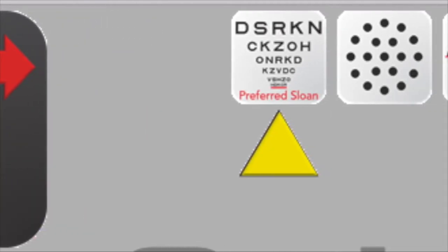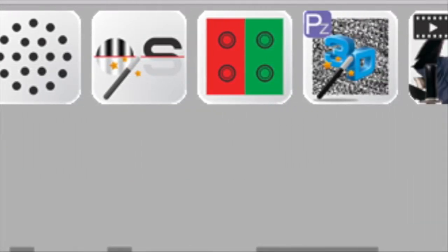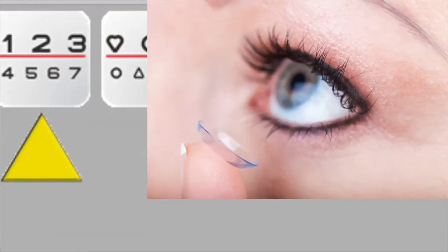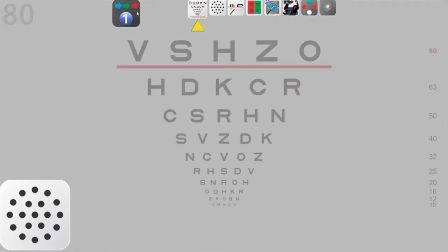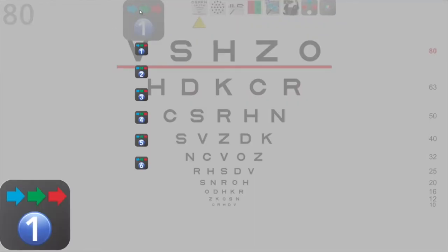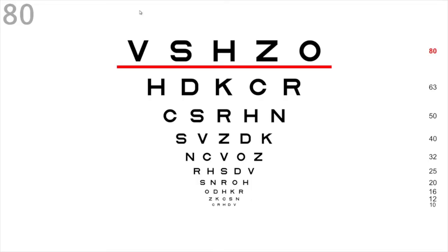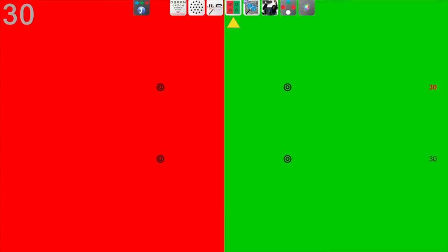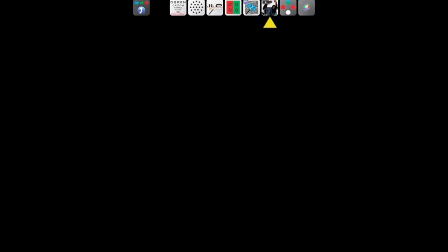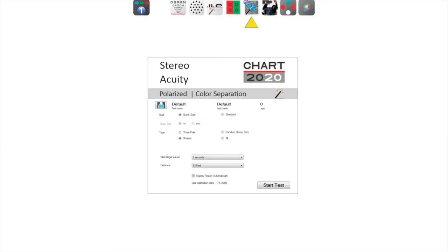For example, Sequence 1 may be a collection of the charts needed for a comprehensive eye exam, whereas Sequence 2 may be used for surgical follow-up or a contact lens exam. Using Sequences enables one-touch progression to the next test without needing to search for a specific chart. To advance to the next chart, press the right key on the remote, right-click the mouse, the right-arrow key on the keyboard, or swipe right on the iPad application. The left button or left swipe will reverse through the progression.